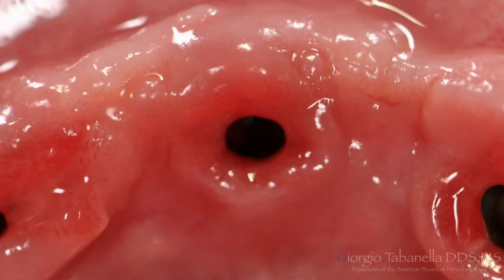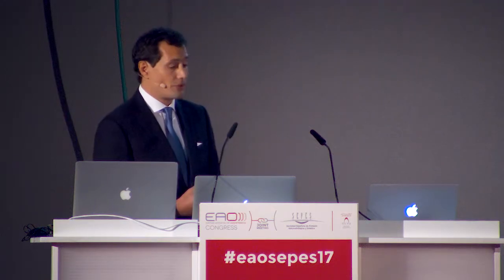Then, of course, the second step will be to manage the soft tissue with a minimally invasive approach, because we cannot certainly do CT graft on every single implant site, but we need to achieve a nice thickness of the soft tissue, not only for aesthetics, not only to provide the prosthodontist with something that can be easy to play with in order to get the illusion of the papilla, but also to create a nice soft tissue sealing around the neck of the implant. I think it's going to be really the future of modern implant dentistry.